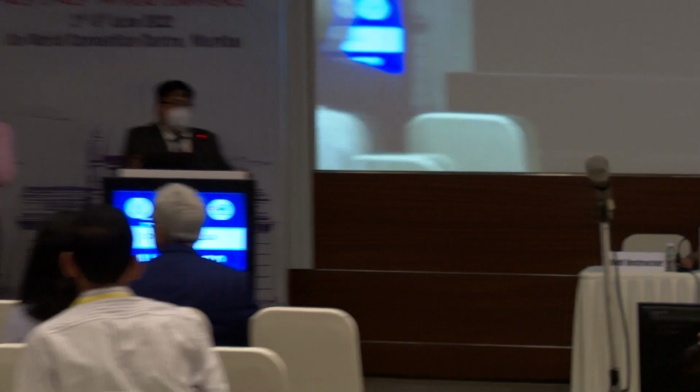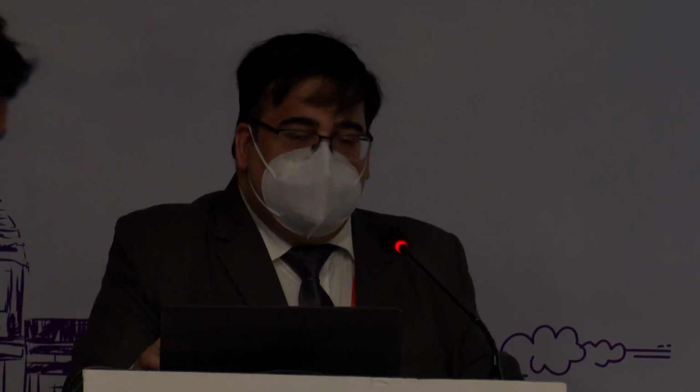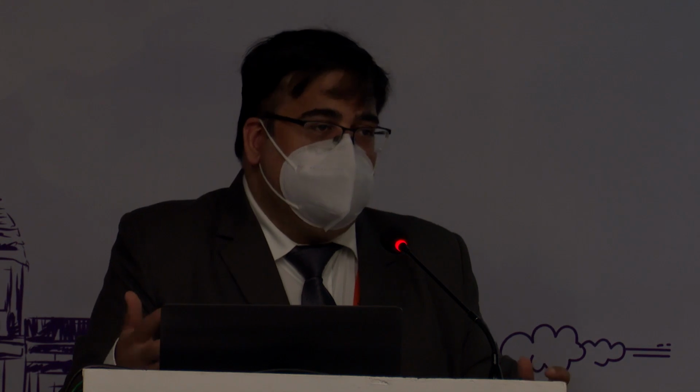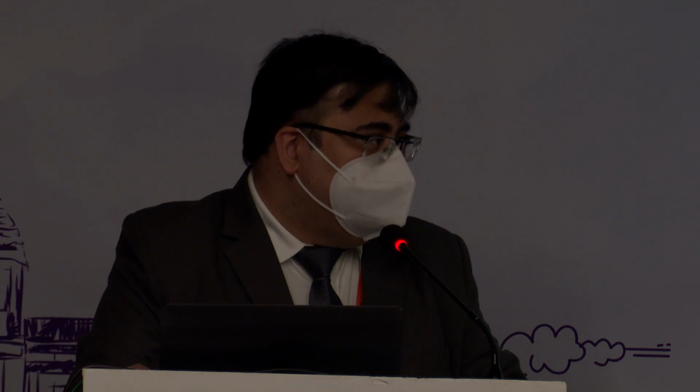I would prefer a 23 gauge. It gives the advantage of being a cannula, so a sutureless entry and exit, but at the same time has a good enough bore to allow enough liquefied vitreous to prolapse out. A 25-27 gauge valved cannula may not be the ideal choice for these situations. And these 23 gauge trocar cannulas are easily available. They are quite cheap and can be purchased standalone. You need not purchase the whole packs for this.